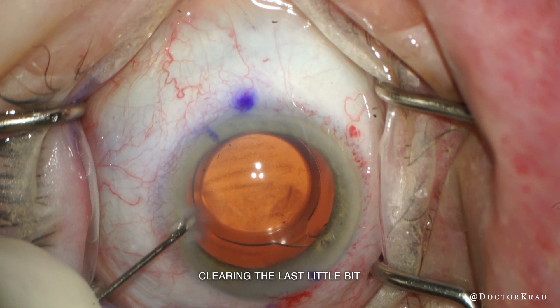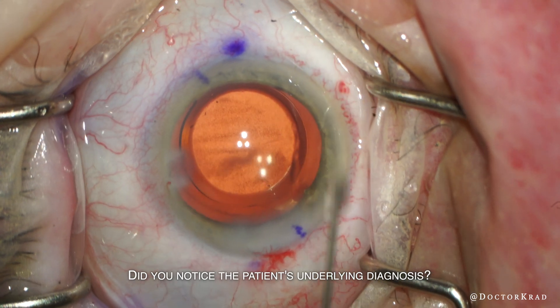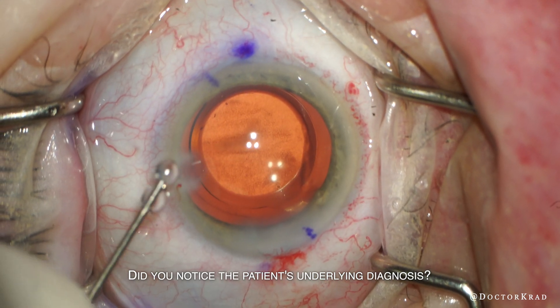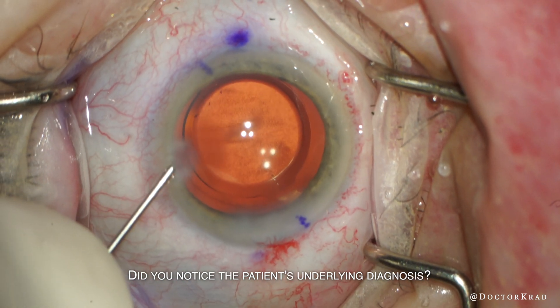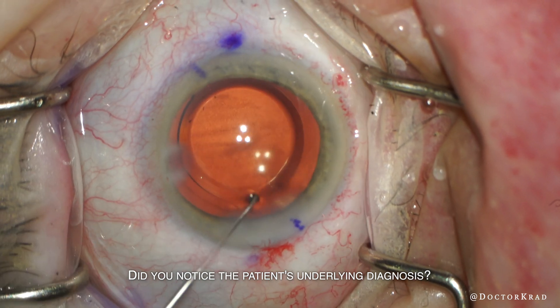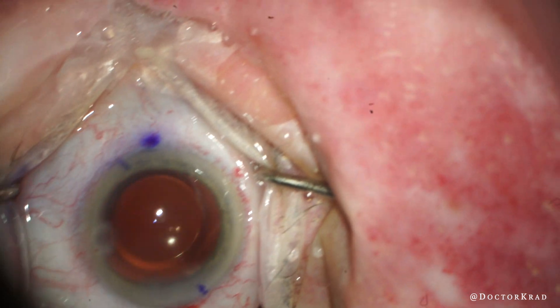Back to normal speed here — just cleared the last little bit. Pressure is good, and I also want to make sure that I never drop the eye pressure too quickly, because dropping it too quickly can make the bleeding start again. And here is your underlying diagnosis.